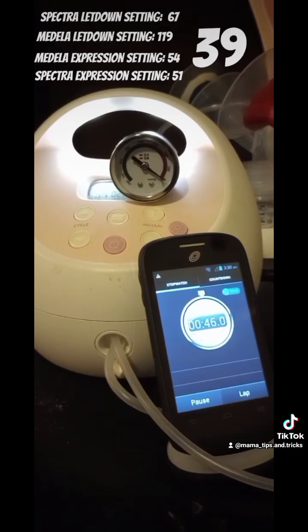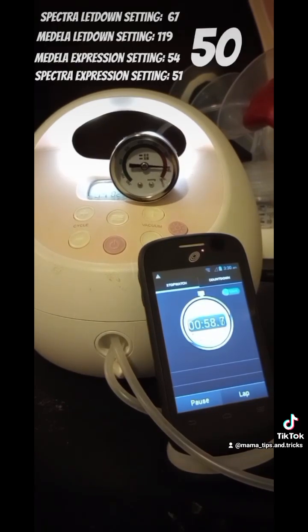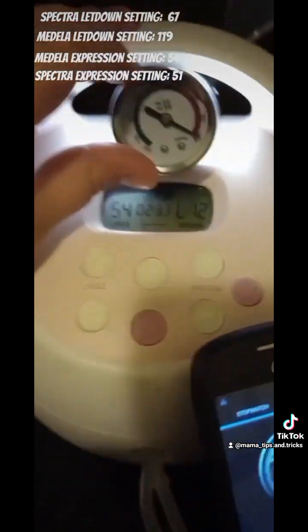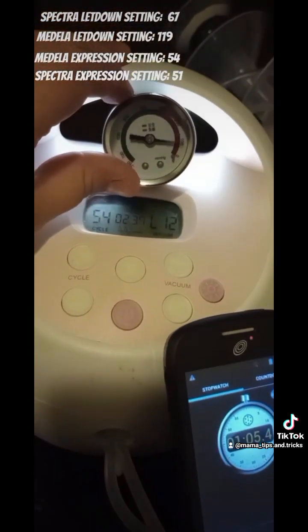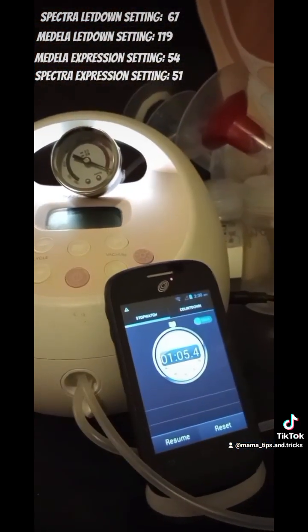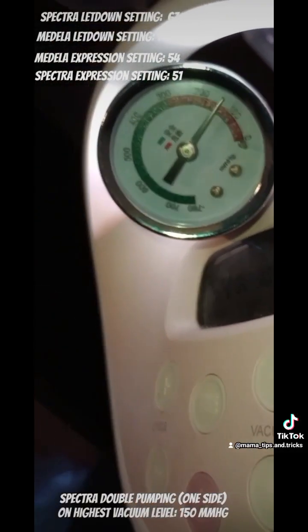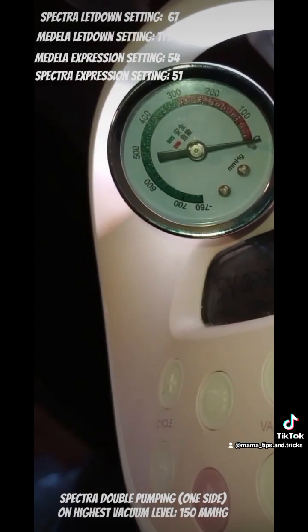I know a lot of people respond better to the Maxflow, me included. I actually do respond better to the Maxflow. Normally, the people who respond better to Spectra respond to a slower pump speed as well as a lower motor type vibration rather than a harder, faster pump. So Medela is harder, faster, and Spectra is lighter, softer vibration and slower kind of pumping.